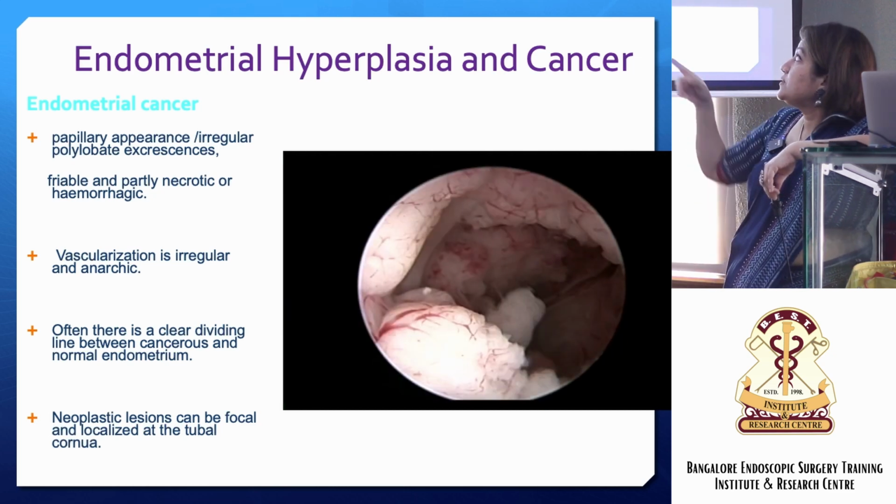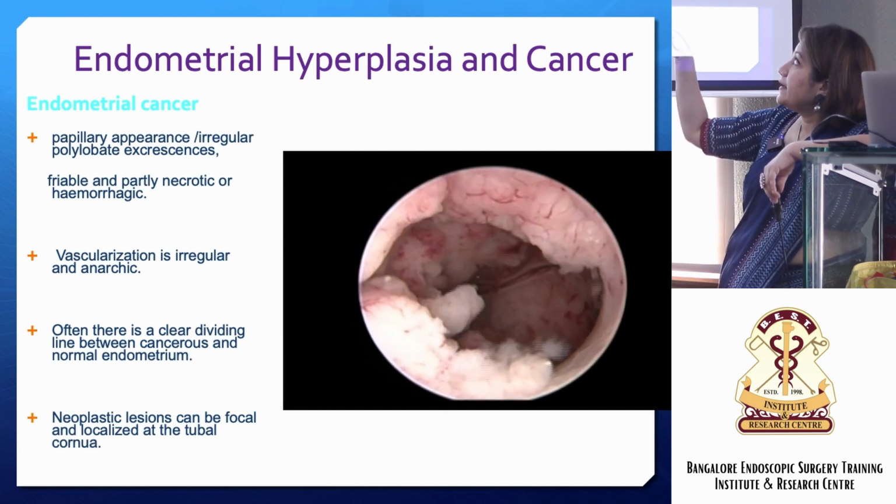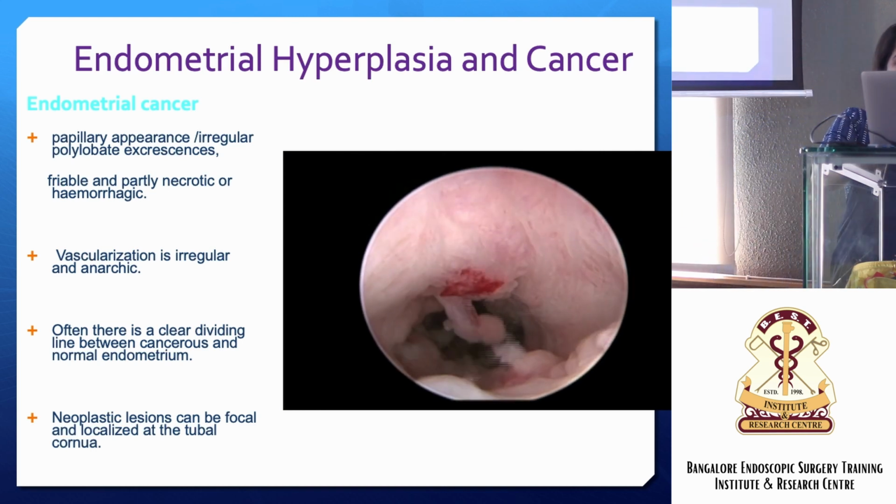I think in this particular case, on curettage nothing much came, but when we went in, it was all like multiple blobs. Then finally, I think we had to use a scissor and cut a few pieces, and it was malignant.